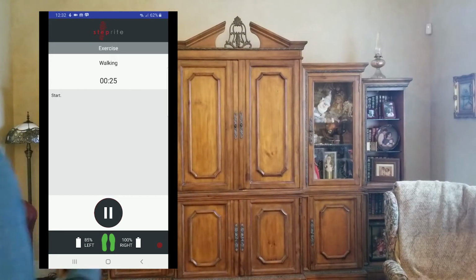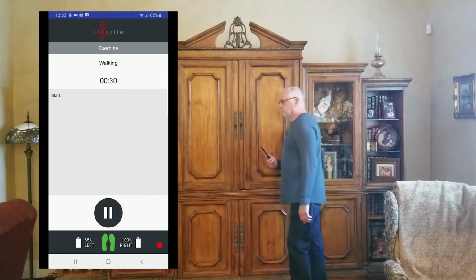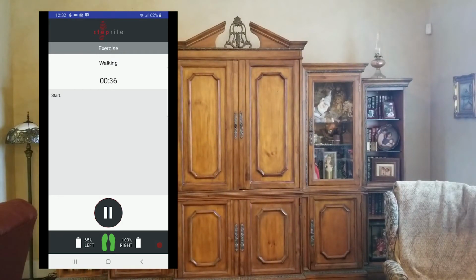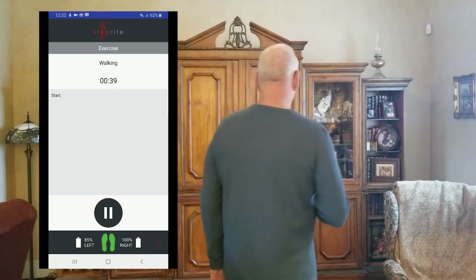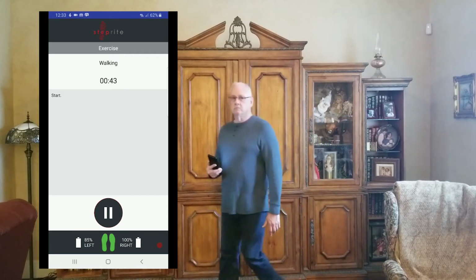The algorithm will pick up that motion, disregard the turning, and simply show the output of the heel to toe strike as the person walks throughout their house. The walking exercises can be set for 1 minute minimum and up to 1 hour as the patient progresses and is able to walk.